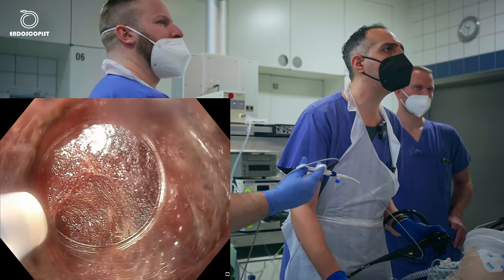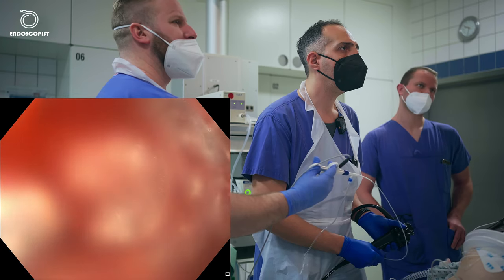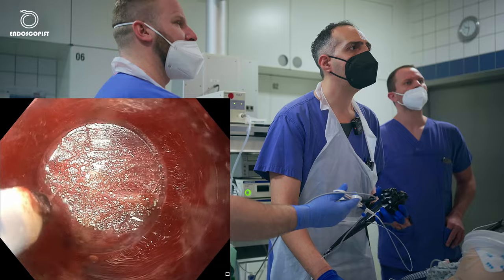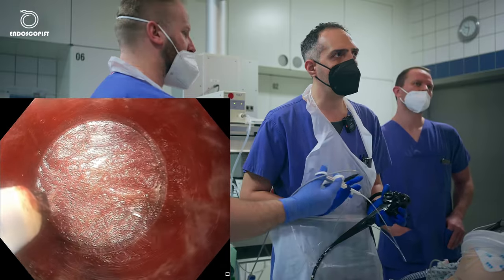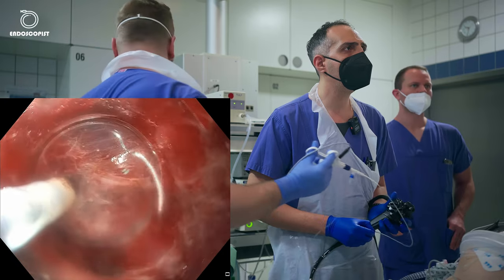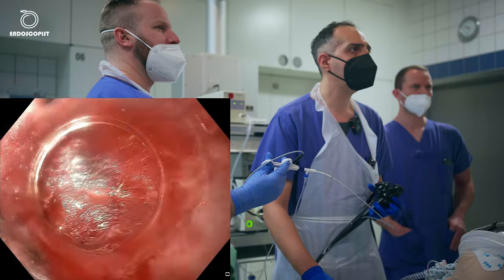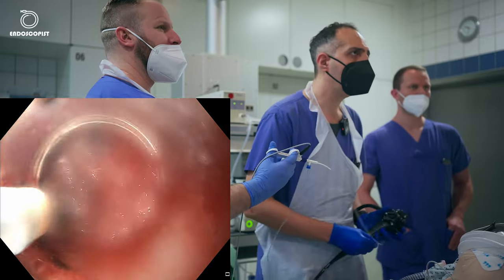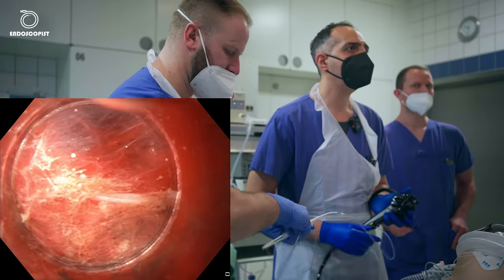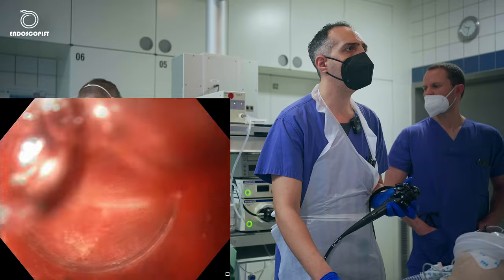We have a bleeder here. So I have a bleeder. I will just keep a pressure on it. We can see it. Again, you can always use the cap to apply some pressure on the bleeder.